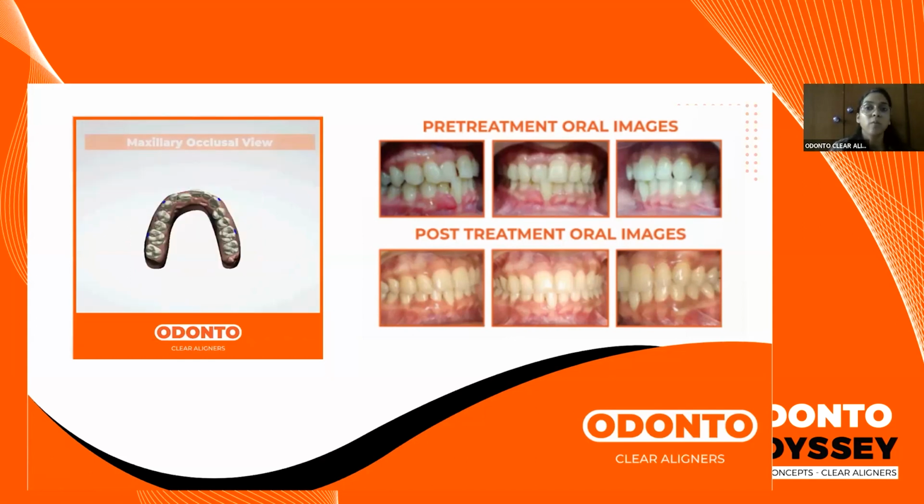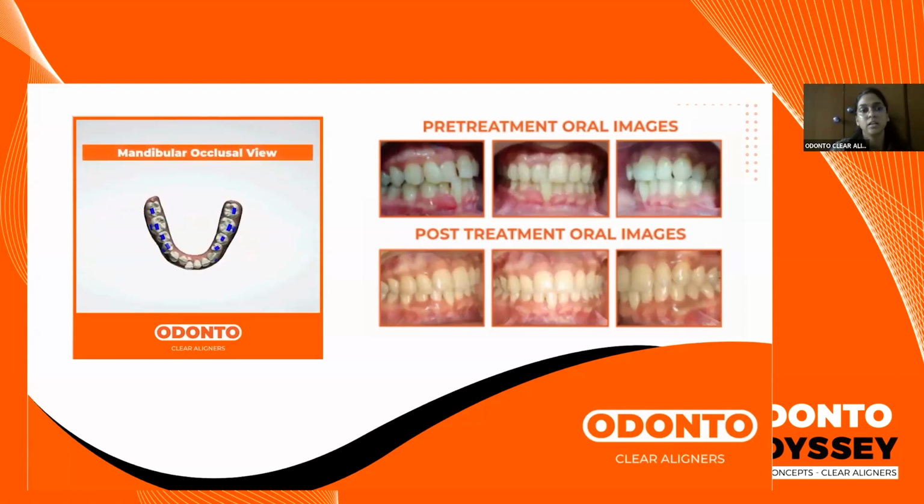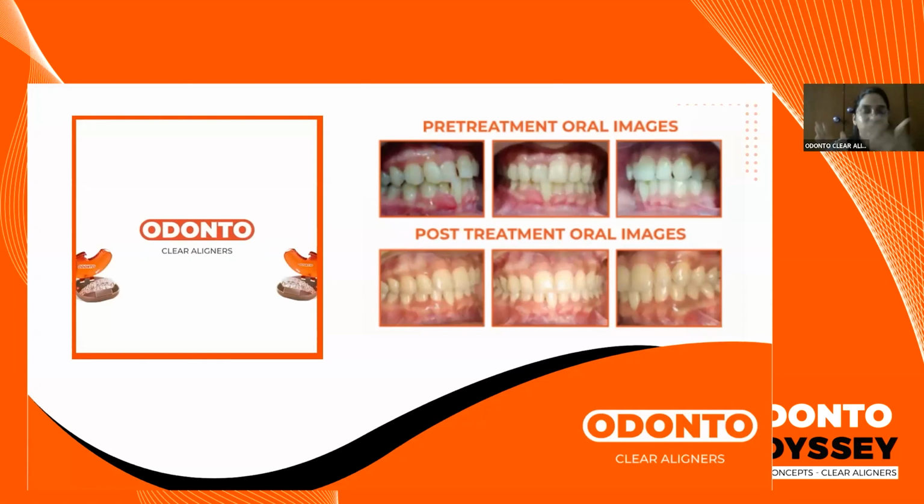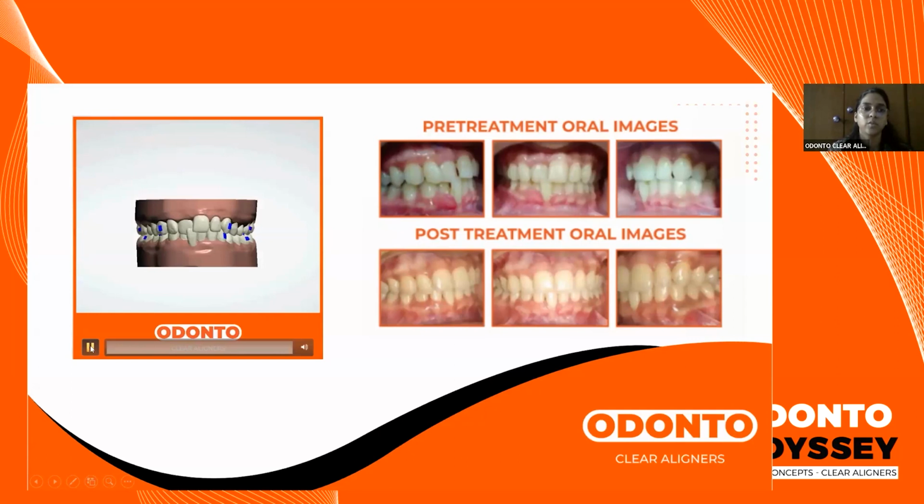It does not require the use of elastics. To this degree, you will not require them. But if it's a really blocked out or instanding incisor, or a posterior tooth, then you will definitely have to move on to something wherein the patient will have to wear elastics to aid that movement into occlusion.